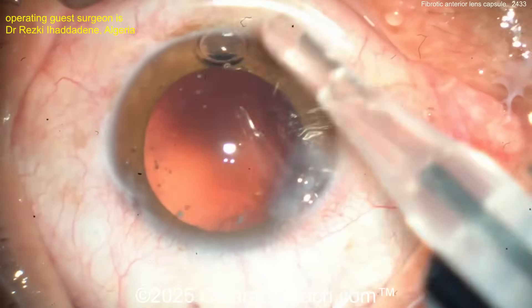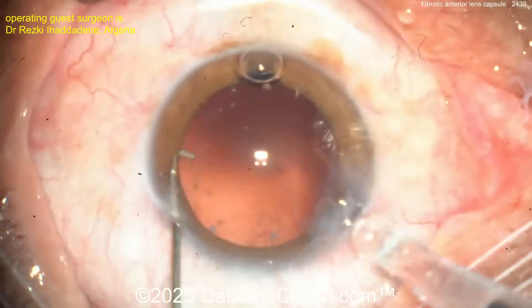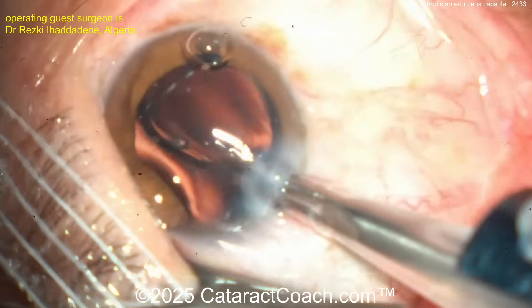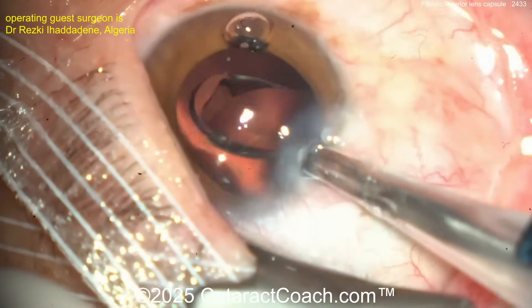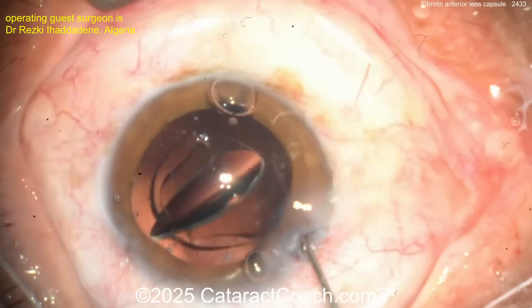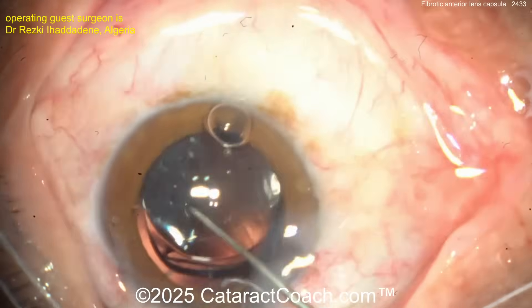There's the viscoelastic filling the capsular bag. It looks like a single-piece acrylic IOL. Get that delivered into the capsular bag. If you've got great technique, send us a video — we want to learn together. Go to cataractcoach.com and there's a link that says 'submit your video' — just follow the directions carefully.